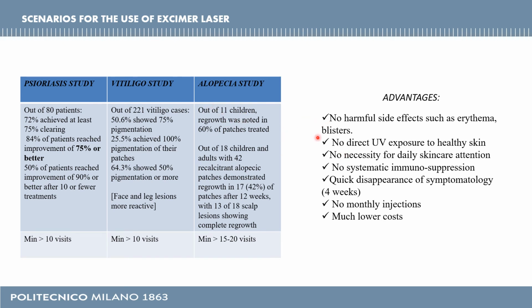Moreover, for what concerns the possible scenarios, we have first of all lots of advantages that come from the use of this therapy involving the excimer laser. First of all, we don't have any harmful side effects like erythema or blisters. We have no direct UV exposure to healthy skin, no necessity for daily skincare attention. We have a quick disappearance of symptomatology, no monthly injections, so the procedure is not excessively dilated in time, and much lower cost. So in general, it is not too expensive or demanding in financial terms.